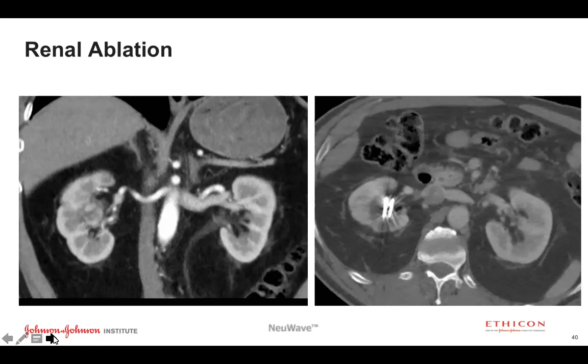Here's a situation where with a central tumor, you might have to give contrast during the ablation to really identify the margins of the tumor because it's not sitting exophytic off of the parenchymal edge. So here's our ablation. Immediately after ablation, you can see the zone of ablation has a hypodense structure along where the contrast was given, again, to confirm that we've in fact covered the lesion.